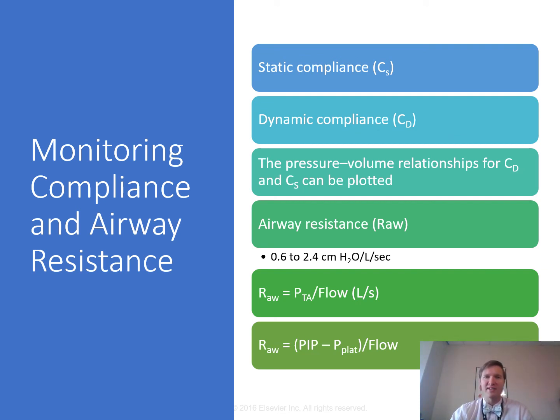When we're looking at this, the delivery of pressure may become dangerously high in these Raw patients. A decrease in dynamic compliance could result in a reduction in their delivered tidal volume as they're on pressure control ventilation. Pressure, therefore, might need to be increased to give them appropriate tidal volume. If they're on volume control ventilation, a decreasing PIP with a constant delivered tidal volume might mean their compliance is improving, or their Raw has been improving, like the bronchodilators are finally kicking in. It's important to measure the delivered tidal volumes because a decreasing pressure might also indicate a leak.